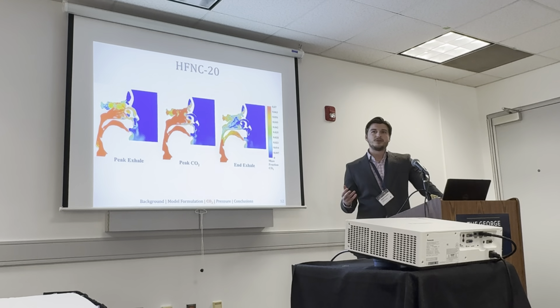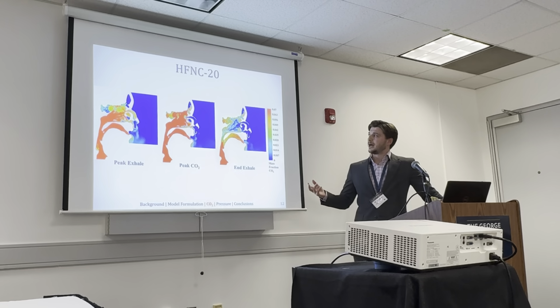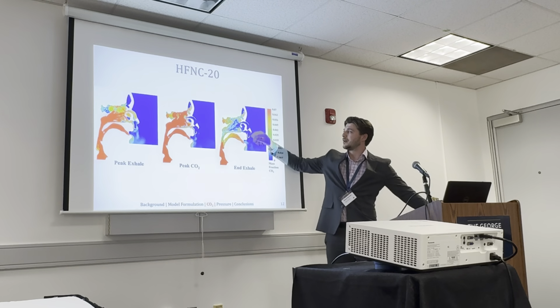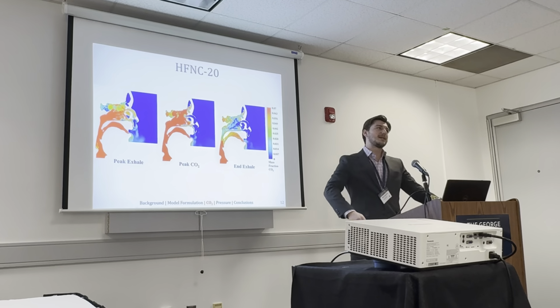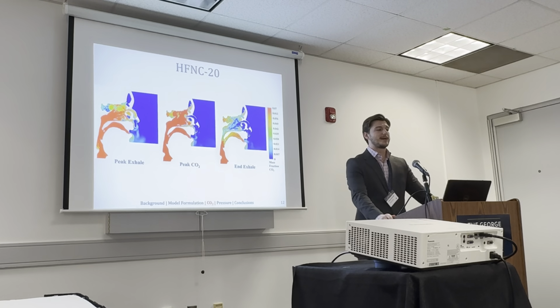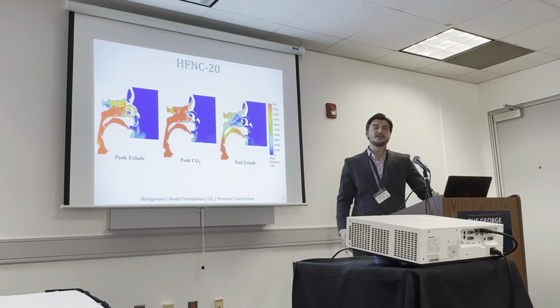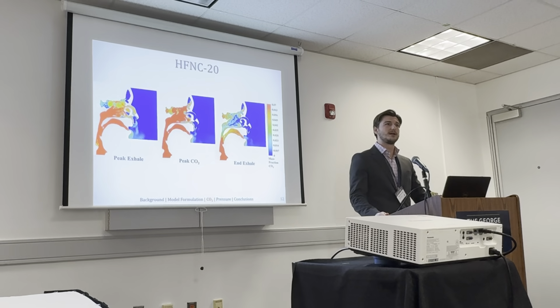And then by end exhale, the therapy does partially recover and is able to evacuate some of this upper airway and force some of that CO2 out of the partially opened mouth, but it's not able to fully recover. So whatever's left in the airway would be expected to be re-inhaled the next breath cycle.